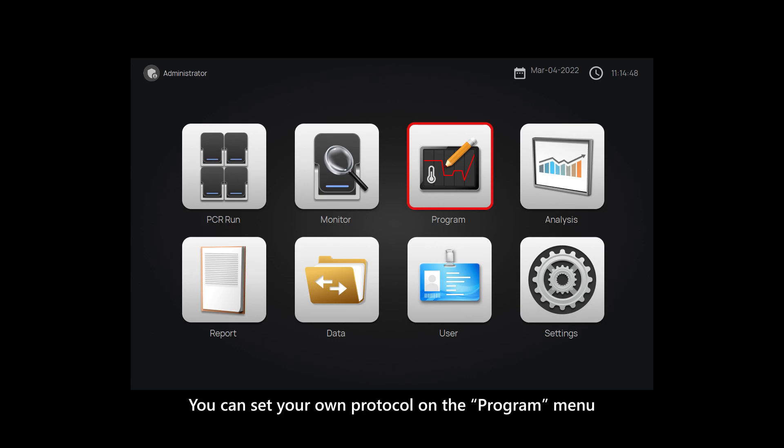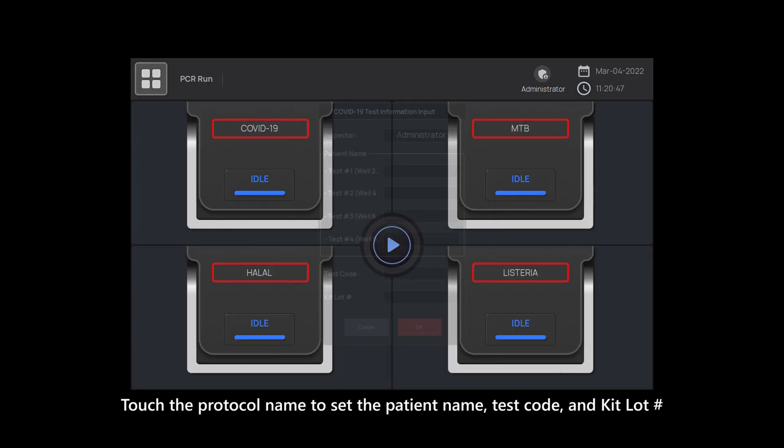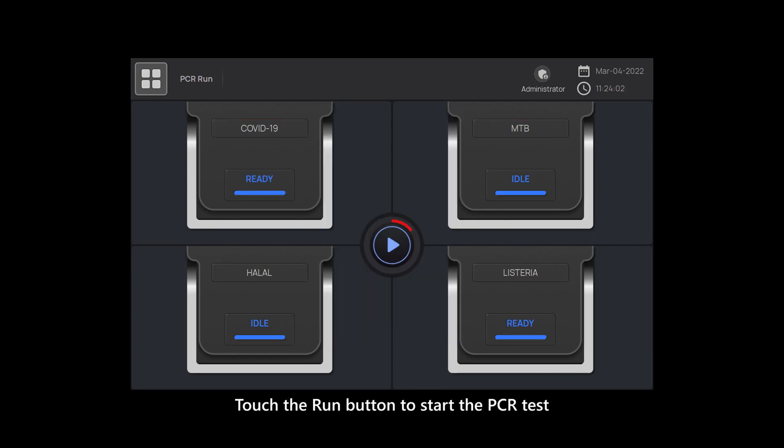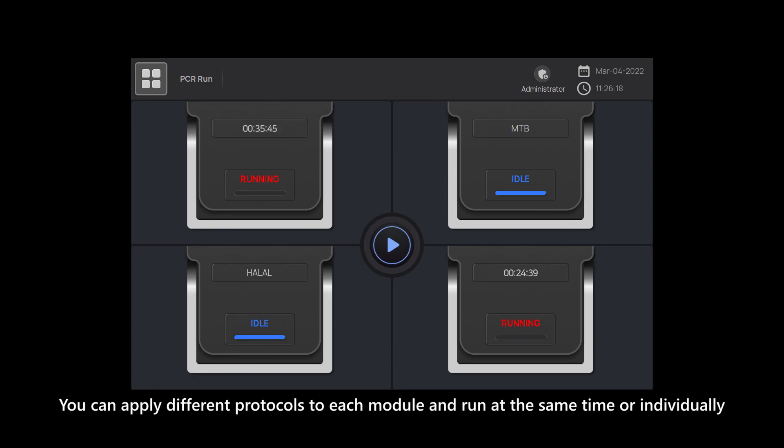You can set your own protocol on the program menu. Touch the protocol name to set the patient name, test code, and kit lot number. Touch the run button to start the PCR test. You can apply different protocols to each module and run them at the same time or individually.